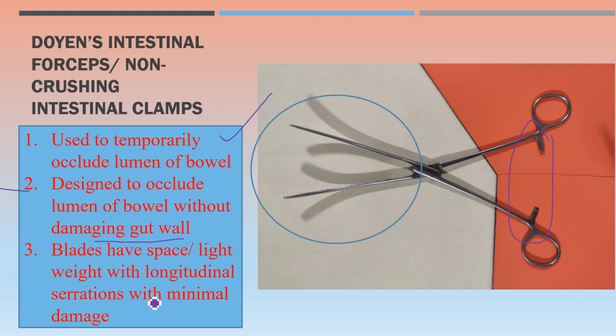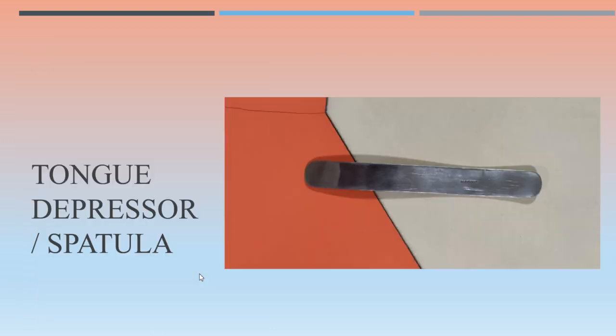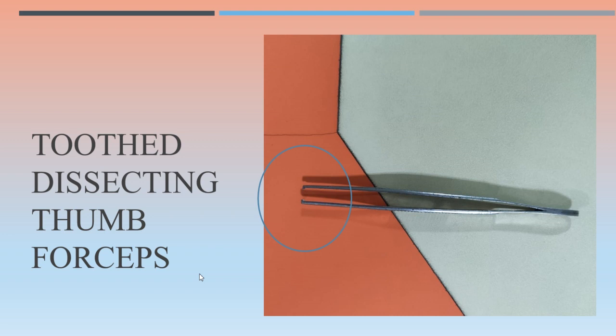This is a tongue depressor spatula used for examination of the oral cavity by depressing the tongue. This is a toothed dissecting thumb forceps — focus on the distal tip.